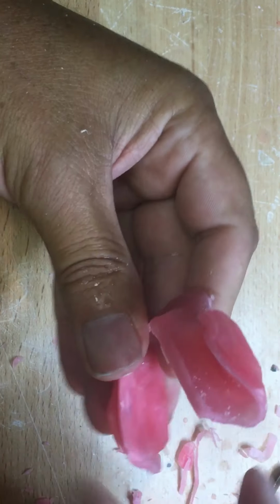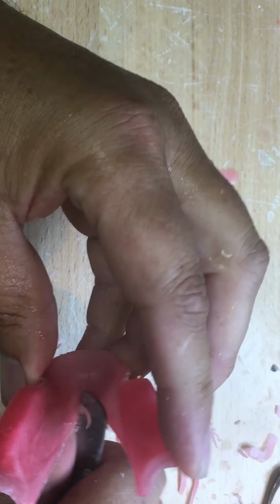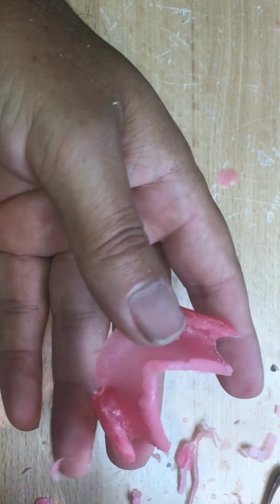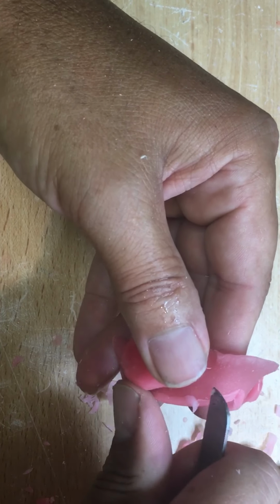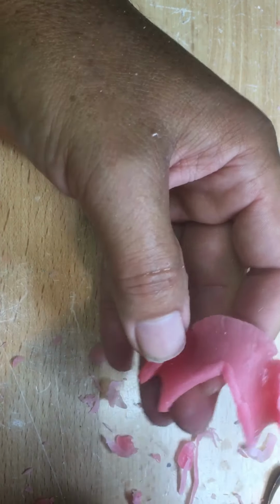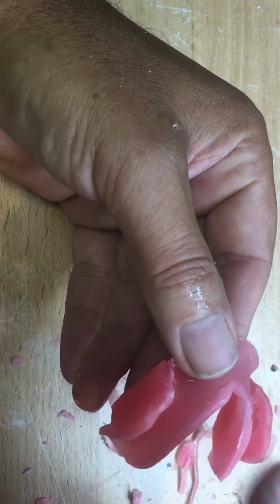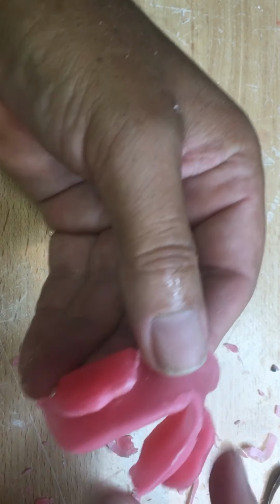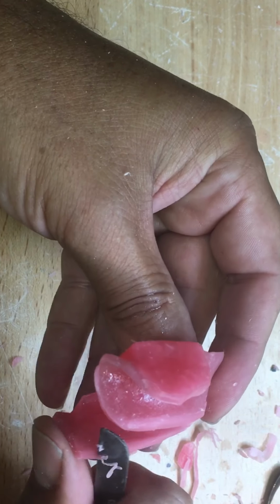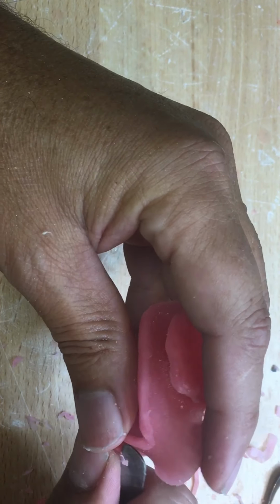Nice and smooth, not sharp. I've got wax border here. Why the wax border again that I chose? Because I find these days the dentists are not border molding, and if they're not border molding effectively in the free end or in a denture situation, if I do it in wax, then this can quickly be reduced chairside with a knife if it's overextended. Plus it's more comfortable for the patient.